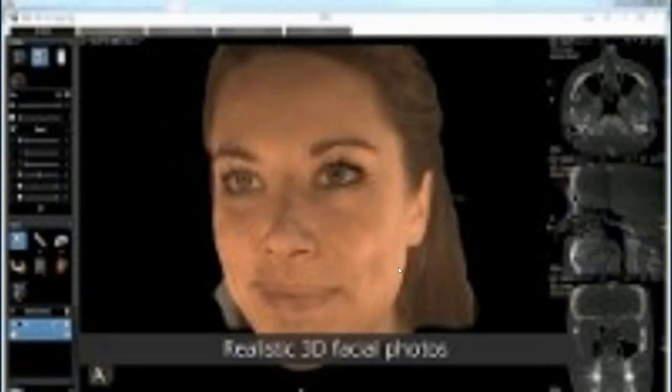So with our clinic, knowing that we're doing all this digital stuff and lots of implant planning, we went all out, and I think the Carestream 9600 is one of the best scanners on the market. But a cool additional feature that it's got that you might use every day, regardless of whether you need a cone beam, is the facial scanner. It does a quick and very efficient and accurate facial scan, and then you can use that in your treatment planning, right? And if you've also got the Carestream ecosystem of cone beam and intraoral scanners, which we have, it will also do the stitching of the models to the face, right?